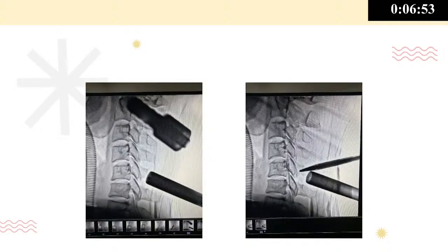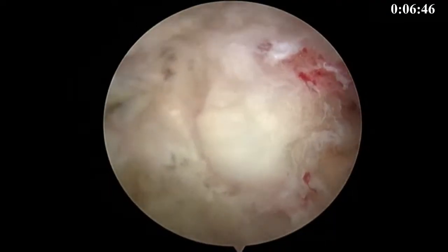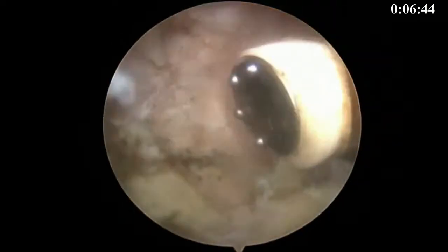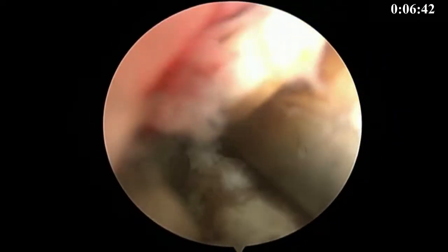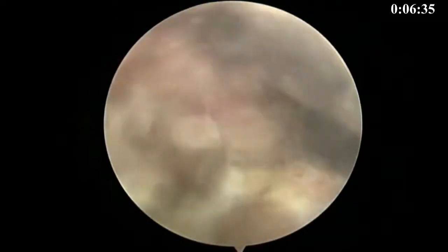I'm not saying that it is always necessary in lumbar. In lumbar spine with certain experience, you can take care of things, but no, in cervical, always and always complete your docking and stripping of tissues, that is a triangulation, in a lateral view live fluoroscopy.